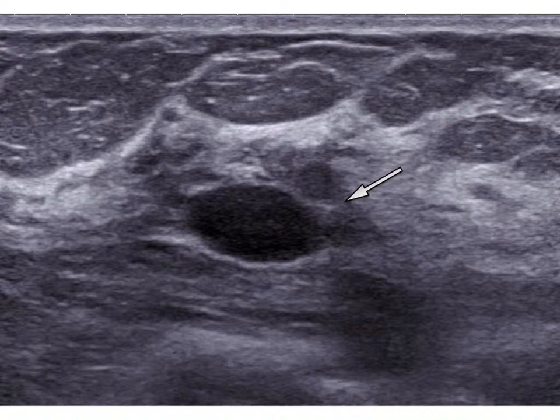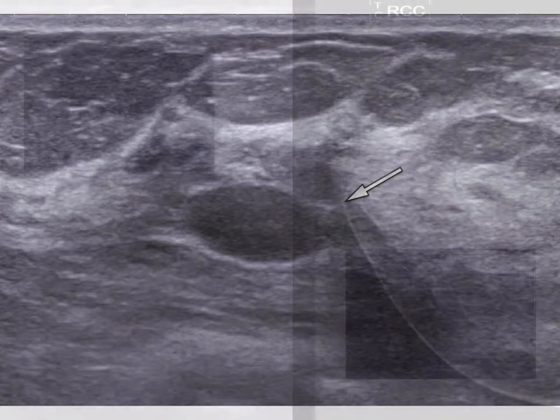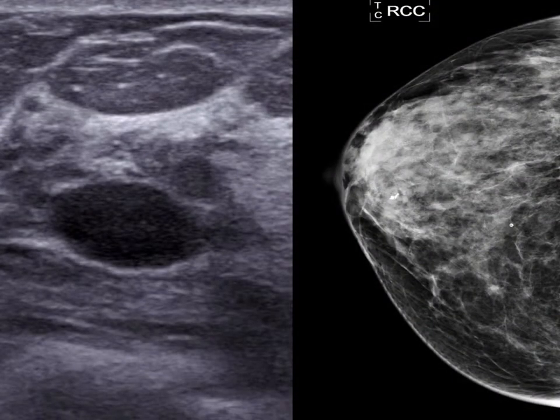In women at high risk of breast cancer, the margin of any solid mass has to be carefully evaluated. On mammogram, this tumor was initially thought to be benign. It was only after the tumor was evaluated on ultrasound that we knew it was cancerous. So, there are two groups of women who are at risk for having a cancer missed on mammogram: women with increased breast density and high-risk women who have risk factors for developing breast cancer in the future.